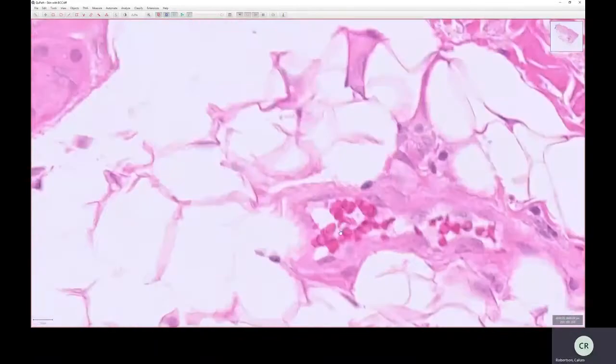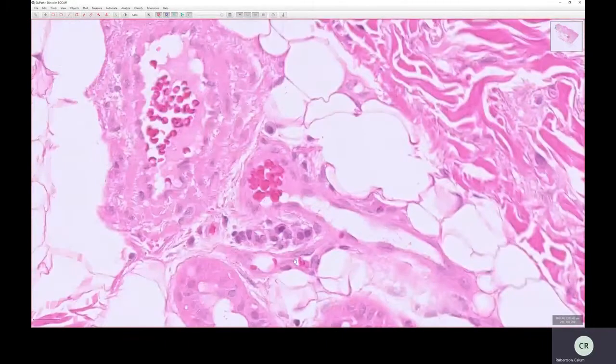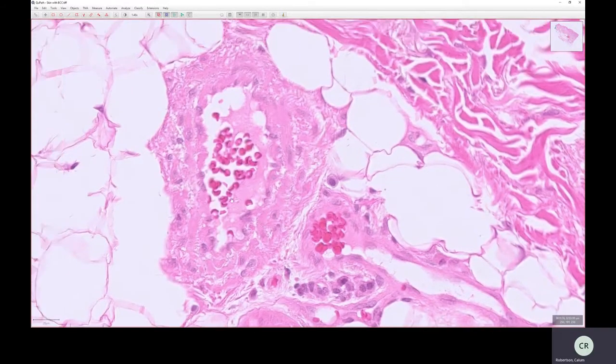Anyway, these red cells that are taking up a lot of the eosin stain are actually erythrocytes, or red blood cells. They're just taking up eosin, so they're not taking up hematoxylin, and that's because they have no nuclear material. They're just all cytoplasm, so they're essentially a dead cell. That's just a peculiarity of mature erythrocytes. All other viable cells will have a nucleus, but erythrocytes don't. And they have this kind of unique concave shape. They're quite distinctive. If a cell doesn't have a nucleus, it's just all eosin, and it has that concave shape.